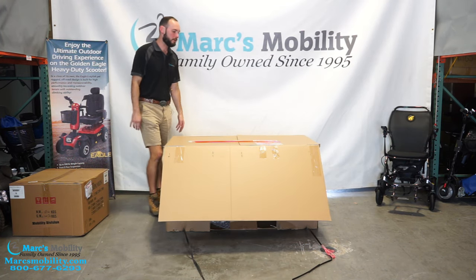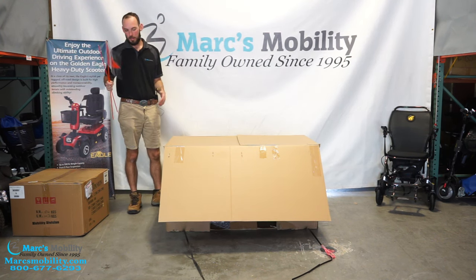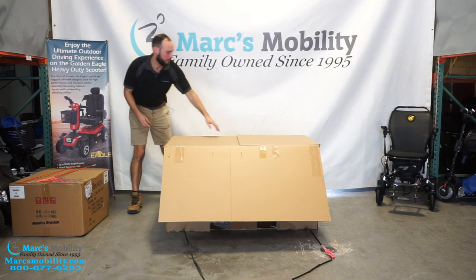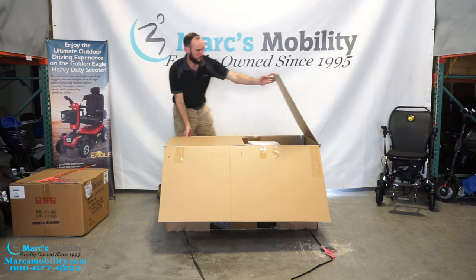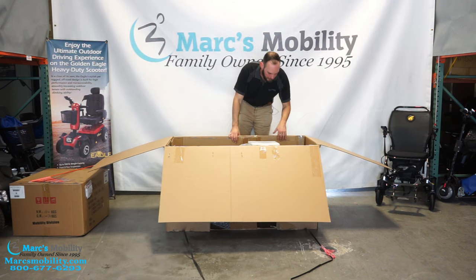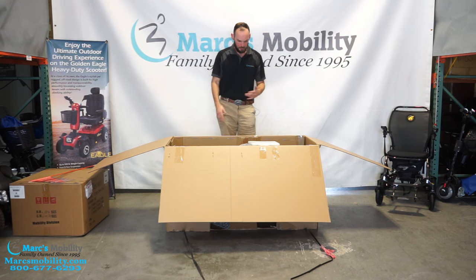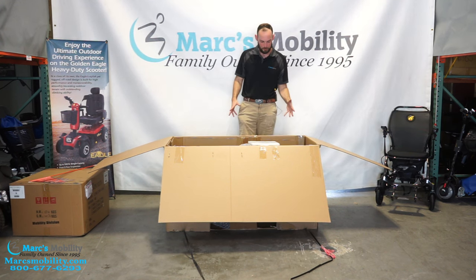We open up the first two flaps and we have the golden flag that comes with all Golden scooters, so I'm going to set this to the side. I'll go ahead and open this up too. It is packaged the same way a lot of the other GC scooters are — fairly minimal trash. I like the way they package these.